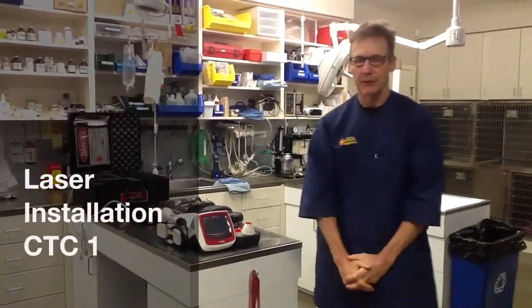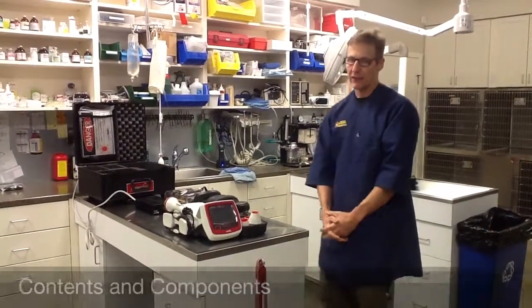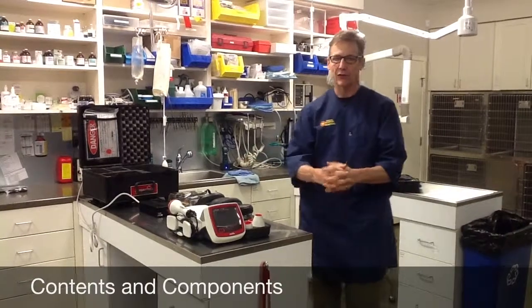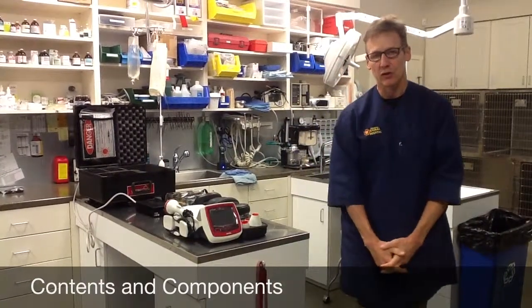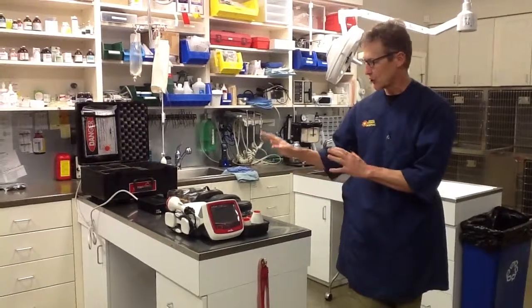I'm Dr. Jeff Smith and I'm going to explain a little bit about the CTC, the Companion Therapy Compact. This is to aid you in using and installing your laser in your clinic. The first thing I want to talk about are all the components of what should have arrived. One thing you're not going to see here is your mobile medical cart, so you'll have to assemble that from the instructions.